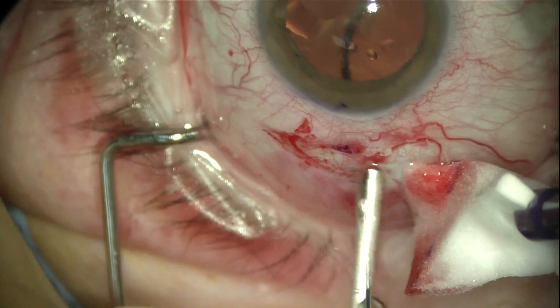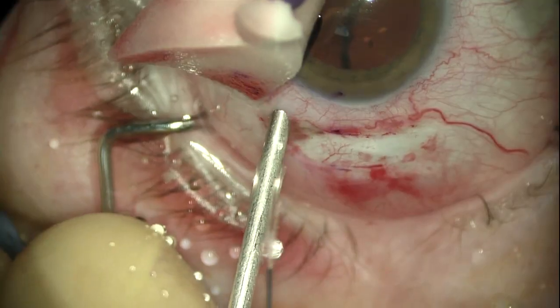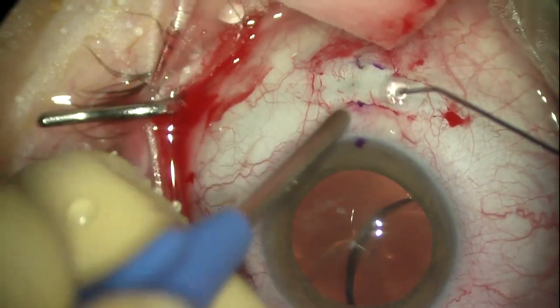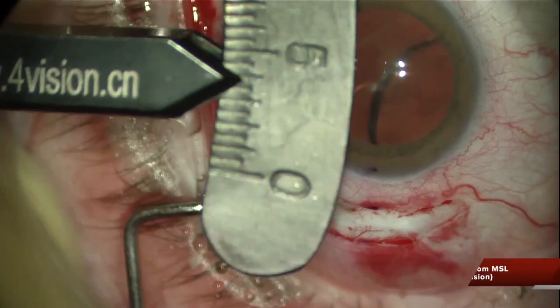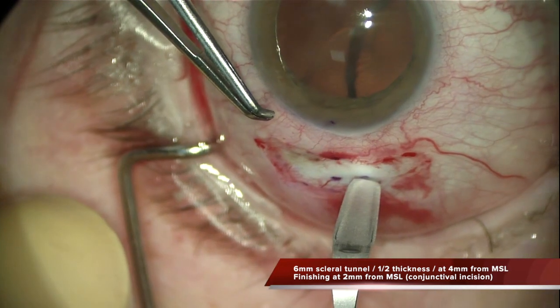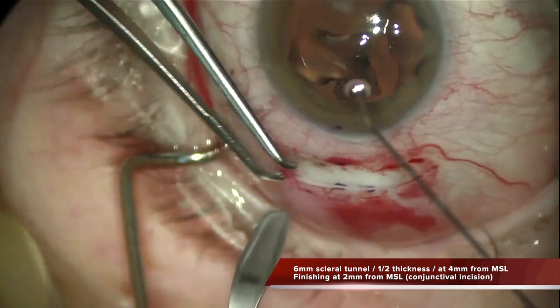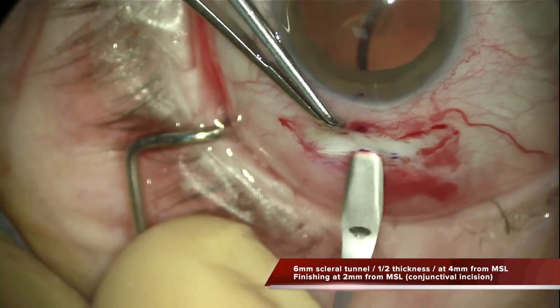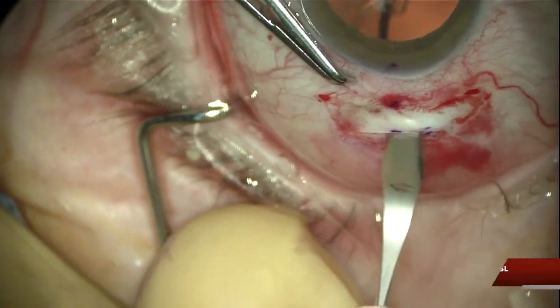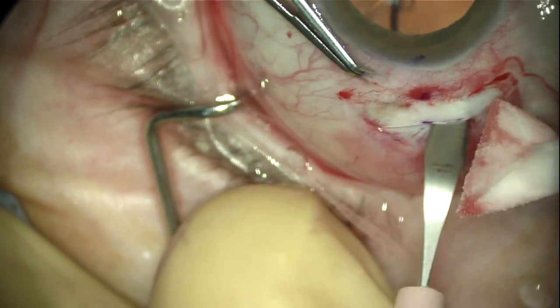The technique is quite simple. You have to create an 8mm incision — a vertical conjunctival incision. Then apply some diathermy and undermine the conjunctiva towards the recti muscles. It is then needed to create a scleral tunnel at 4mm from the surgical limbus, which is going to be 2mm long until it reaches the conjunctival incision, which will be at 2mm from the surgical limbus.